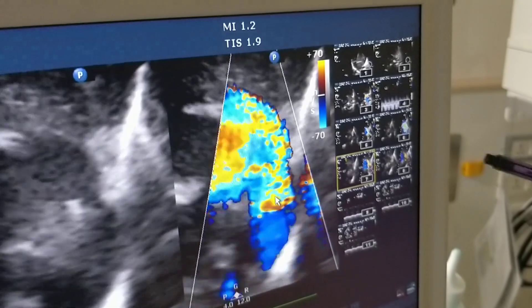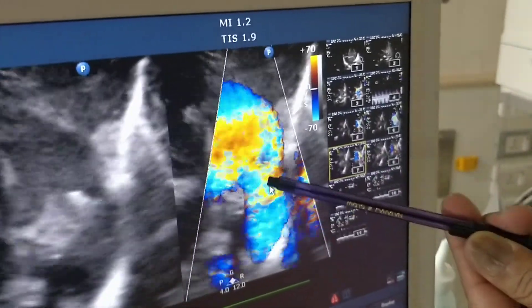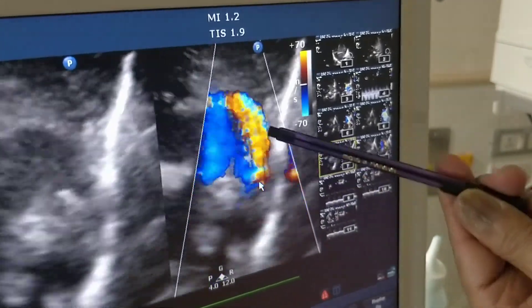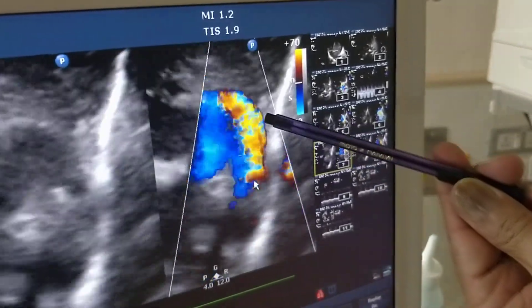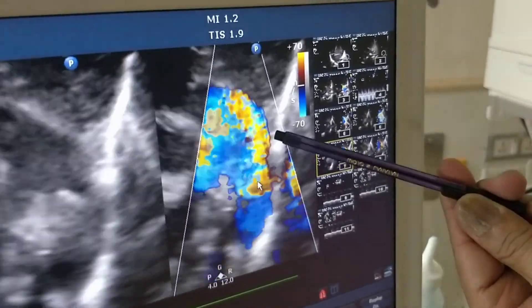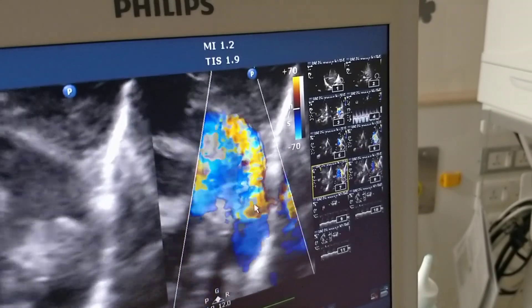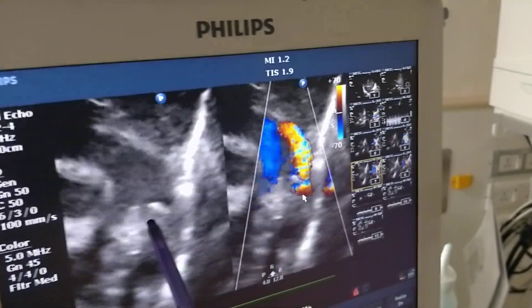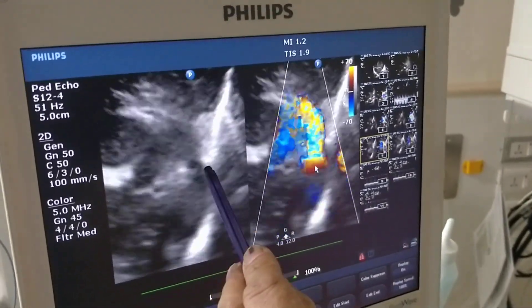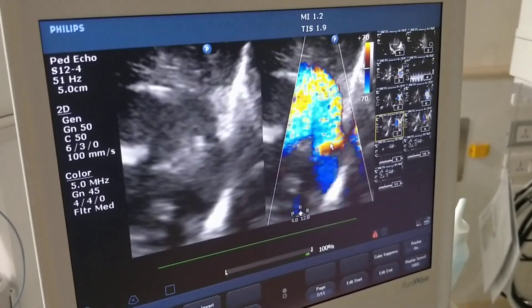If I apply color Doppler, you can see the blue right pulmonary artery, the left pulmonary artery, and turbulence at the ductus arteriosus. This gives the impression of a three-legged chair — leg 1, leg 2, and leg 3 — which is a characteristic appearance of patent ductus arteriosus on color Doppler.